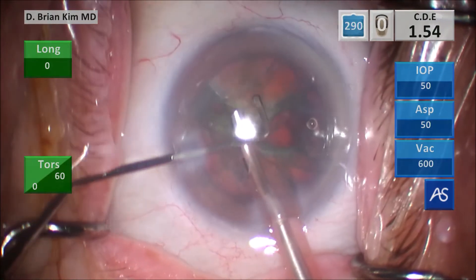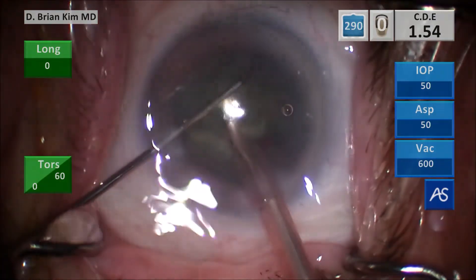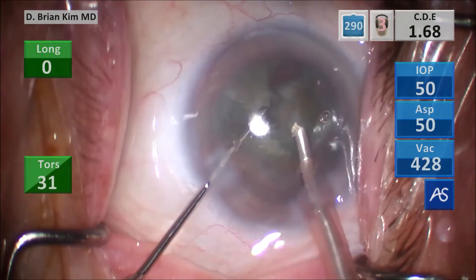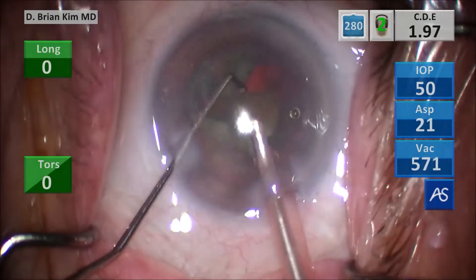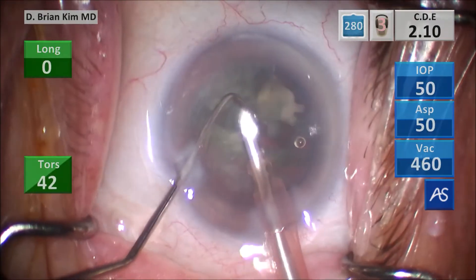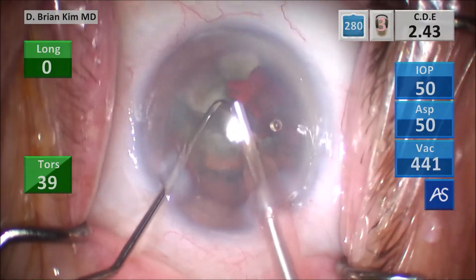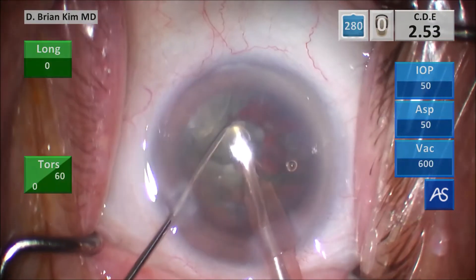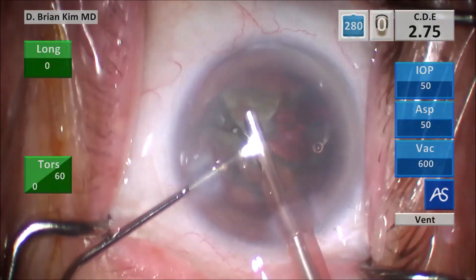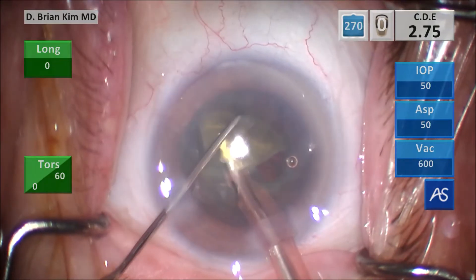I'm turning the second quadrant in front of me, placing the chopper around the lens, crushing it against the phaco tip, crushing the lens into smaller and smaller pieces, and then emulsifying the lens pieces. You can see there's quite a bit of density to this lens — you know that because when I bring that chopper towards the phaco tip, there's a sudden loss of resistance and a snap when I'm fracturing the lens, and you can feel it between the instruments. That snap or loss of resistance is an indication of that lens density.